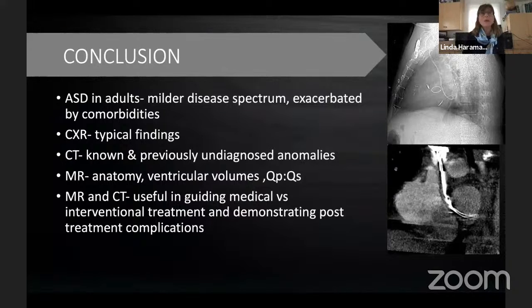If we know that there's a defect, or if we have echocardiographic evidence for right-sided cardiac dilation, we might want to do an MRI. That's the best study to look both for the anatomy and to best estimate the ventricular volumes to directly measure shunts. We can do MRA to look for associated venous anomalies.